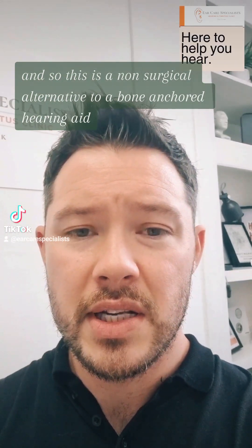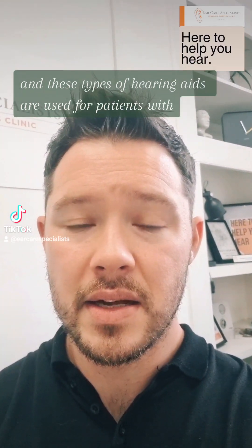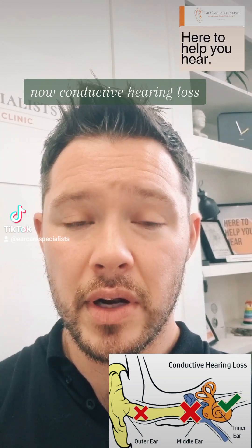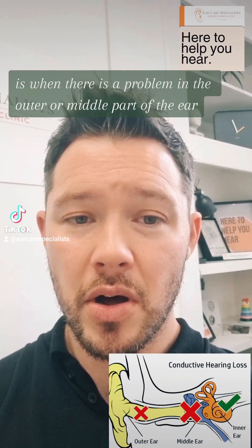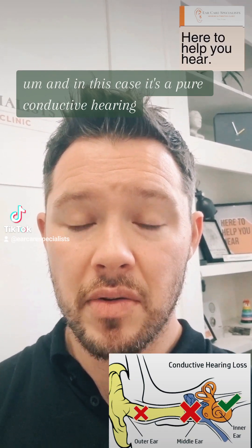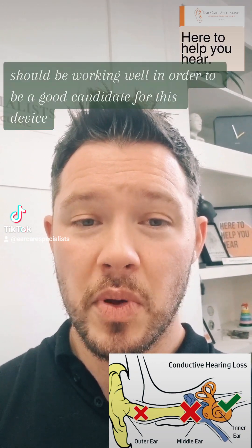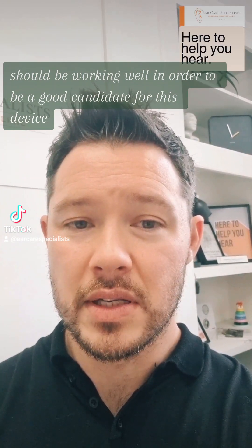This is a non-surgical alternative to a bone anchored hearing aid, and these types of hearing aids are used for patients with conductive hearing loss. Conductive hearing loss is when there is a problem in the outer or middle part of the ear. It's a pure conductive hearing loss that it's suitable for, meaning the cochlea and the nerve of hearing should be working well in order to be a good candidate for this device.